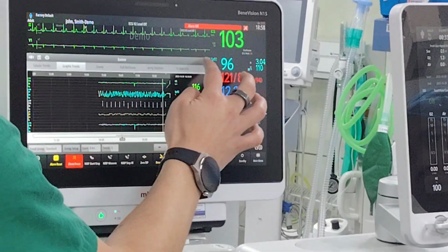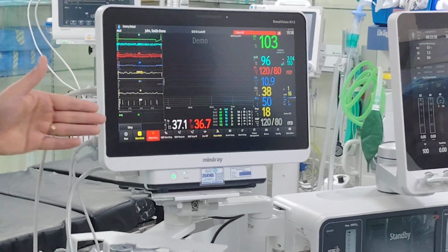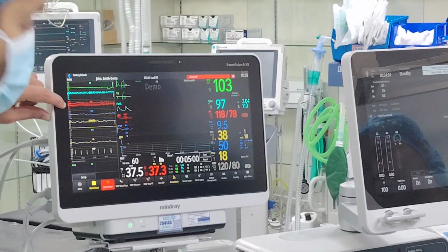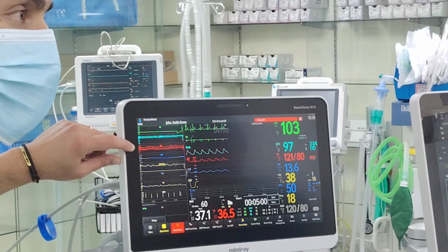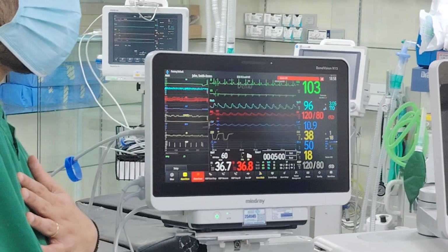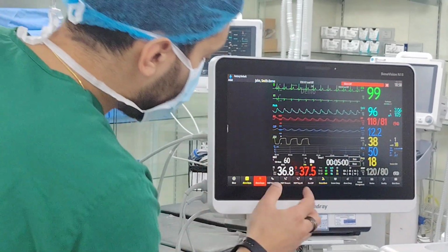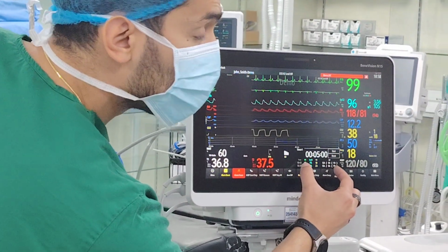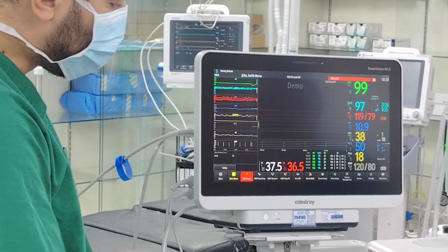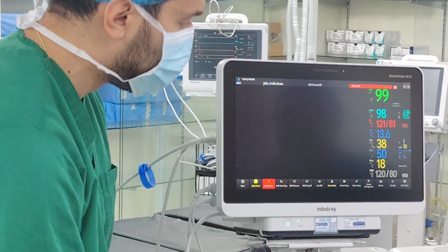Okay? Now, what if you want to look at graphical? No need to do all this. What you can do from the computer, look here. You have all this. So today, if you have hypotension or hypertension, it will also highlight for you here. Any alarms, for example, I'm your technician, doctor, right? You want to have a break for 1 hour, okay? You want to come back. You want to see what's happening, right? You can see definitely from here, from these parameters, or you can swipe here, all the alarms that happen, all the data is from here, and then you can make it even bigger.